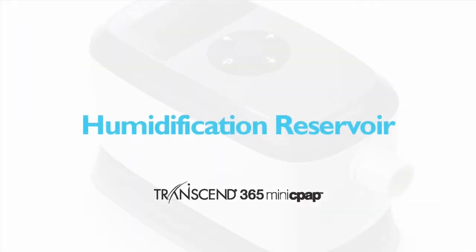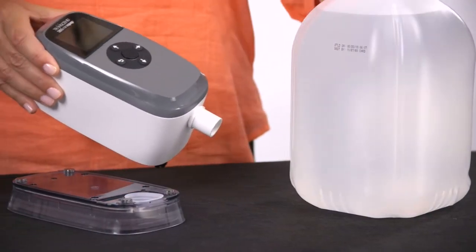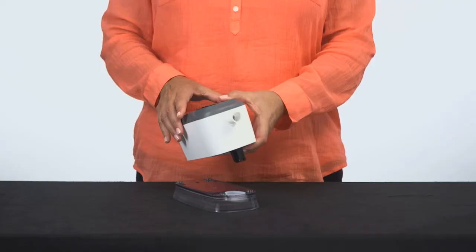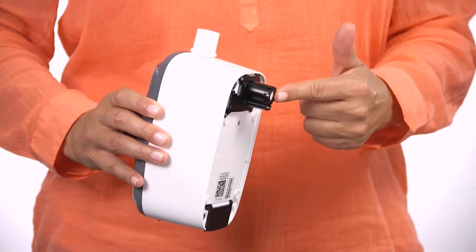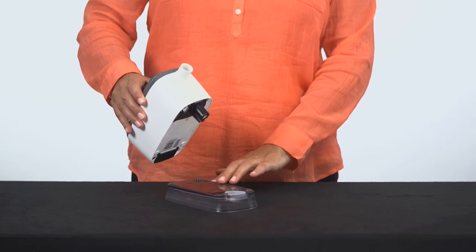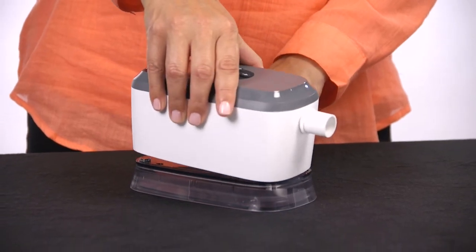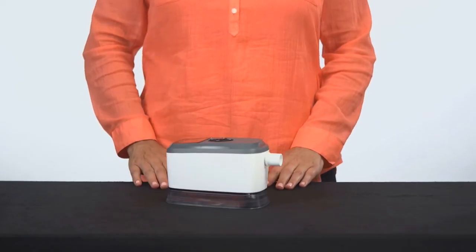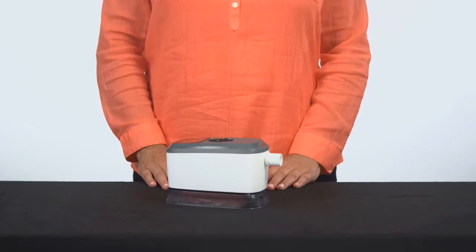365 mini CPAP Humidification. It's important after filling your reservoir to insert the heater wick properly for a secure fit. Here's how. To prevent any damage to the water seal on the reservoir, make sure to connect the CPAP to the reservoir from the wick end first. Carefully seat the heater wick into the reservoir so that it does not catch the reservoir seal. The magnets on the tray will then perfectly seat the 365 device in place. Use the proper method for connection every time to ensure your system continues to operate optimally.